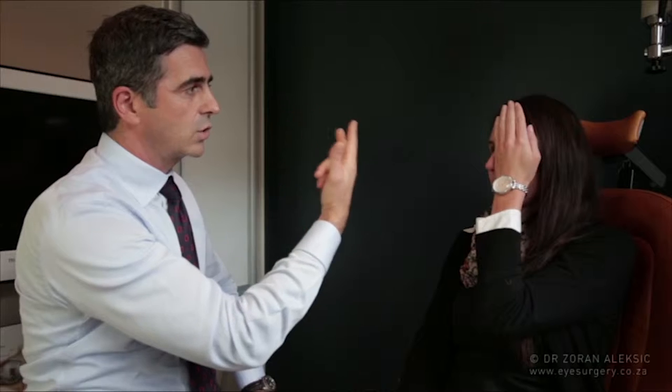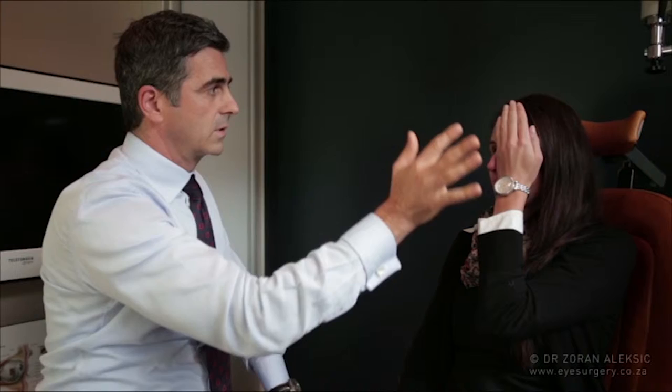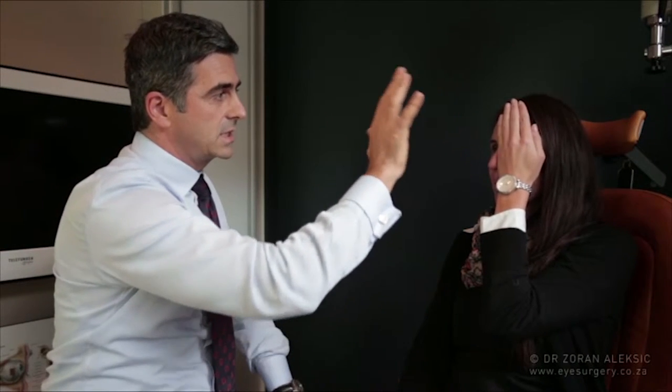If they can see at that close range, they would say, for example, 'it's 3 fingers.' But if they cannot see that, the next step to quantify how bad their sight is, is to ask the patient: 'What am I doing?' If the patient sees this movement, it is marked as hand movements vision, and we know it is in very close proximity to the eye.